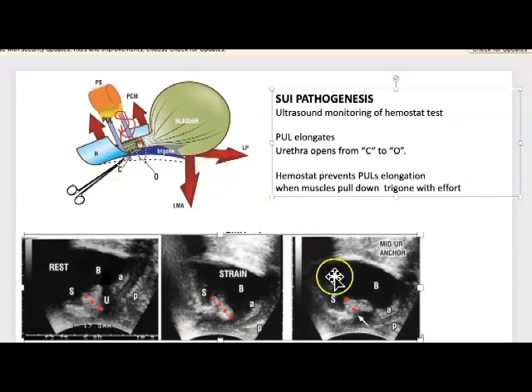Earlier in the video we put the hemostat immediately behind the symphysis. You can see the arrow — that is the hemostat — and it holds the pubourethral ligament in place. It does not allow it to elongate. Look what happens: the urethra closes, the bladder neck closes, and it closes distally.